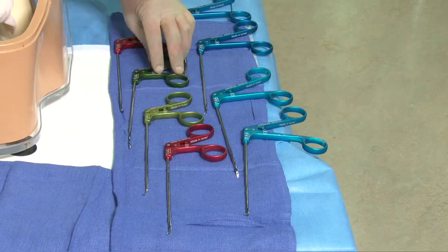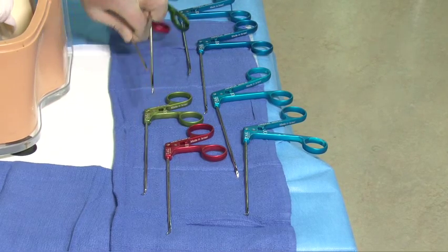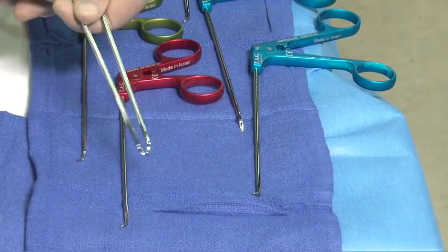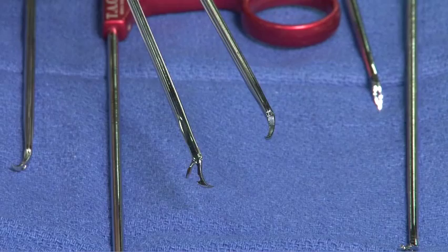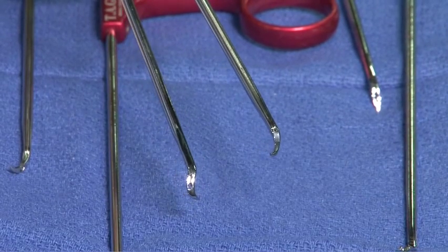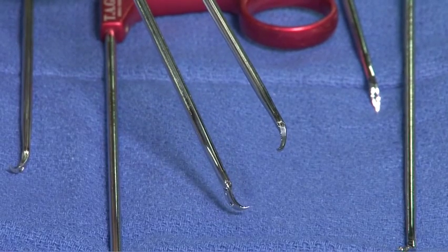If we take both of the clever hook devices, we see that the jaw on each side opens inferiorly. By opening inferiorly, it allows for a very precise penetration through tissue and then retrieval of any type of suture.